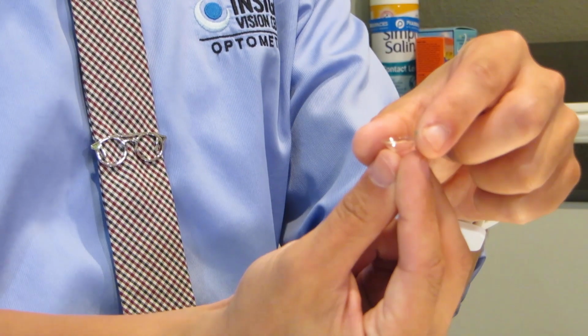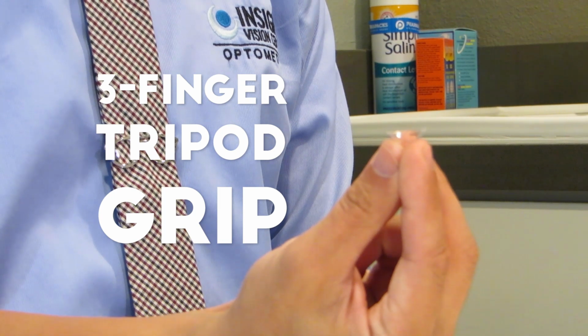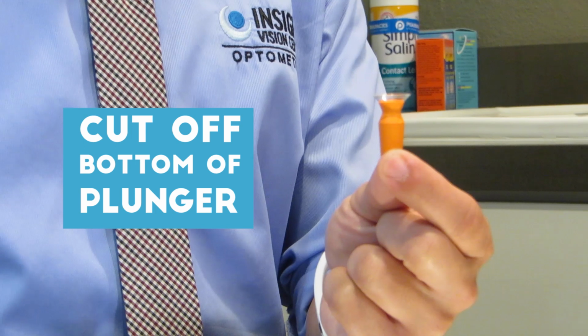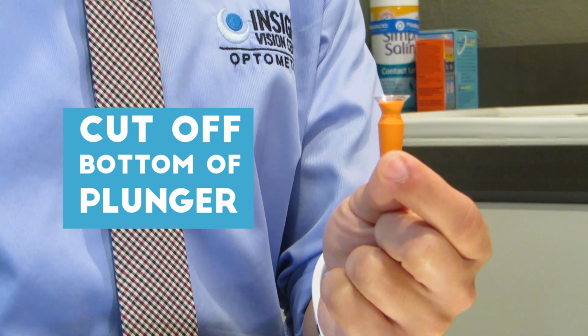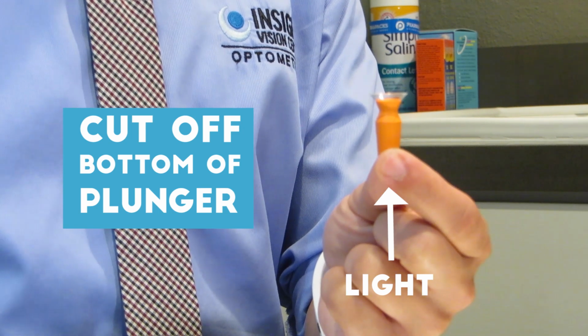If you don't have an insertion plunger handy, you can also use the 3-finger tripod grip to hold the lens. One tip some of our patients have found handy is to cut the bottom off the DMV insertion plunger. When inserting the lens, look for the light coming through the plunger, as this will help to keep your eye steady.